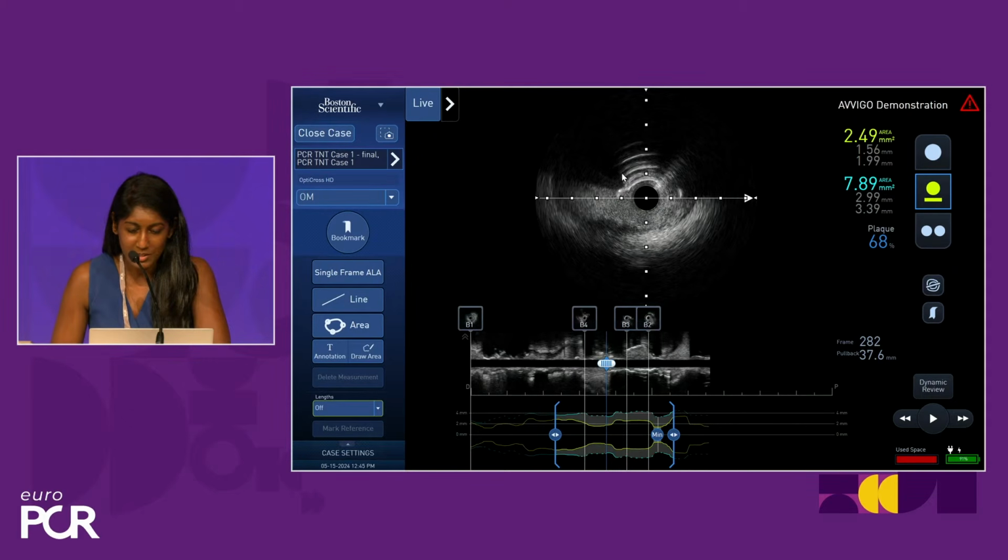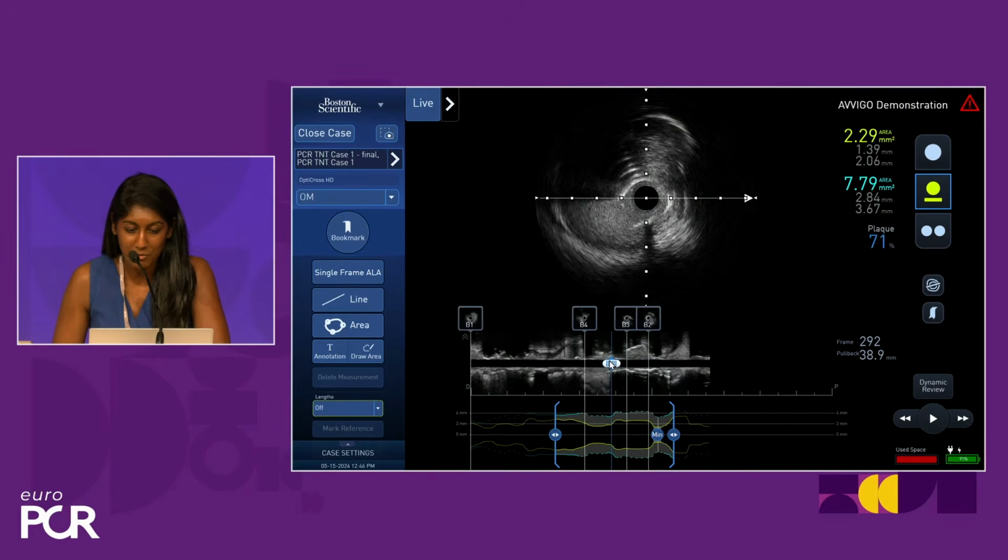So just this part here where you've got wire bias, which is favorable because your IVUS catheter is actually towards the area of the calcium and where the nodule is, probably behind this. And so you're more likely to make contact with the calcium here. Here, the burr has made contact, so you see this reverberation artifact, which is effectively where the ultrasound waves are now able to escape past the calcium, and so you get this artifactual appearance. So when you see that after rotablation, you know that the rotablation's had some form of effect.